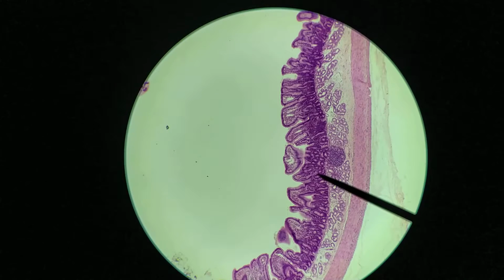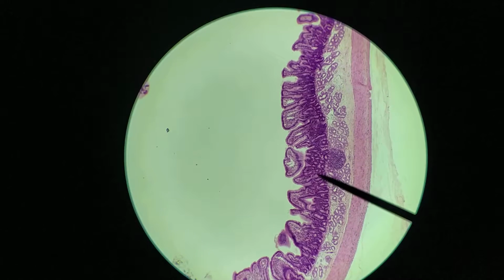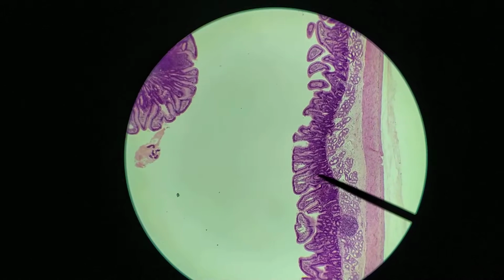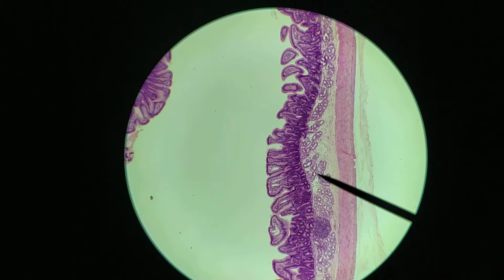Hi everyone. In this slide we'll be looking at the small intestine. Now this one is actually a composite slide, and so it contains all three different types of the small intestine. So we're going to start on this first section, and based on what I'm seeing here, I can tell you that we are looking at the duodenum of the small intestine.